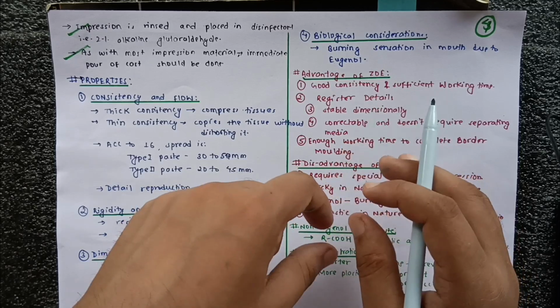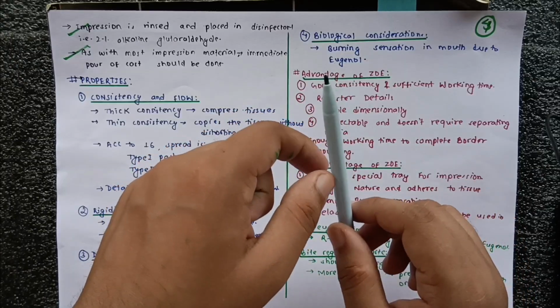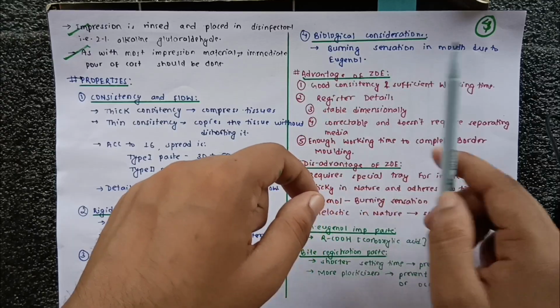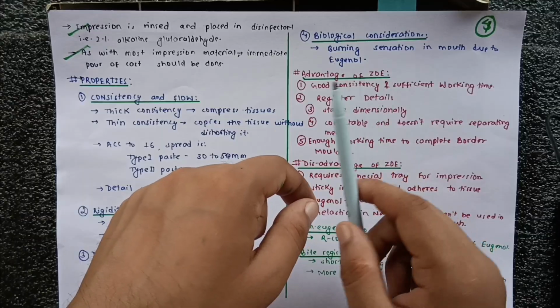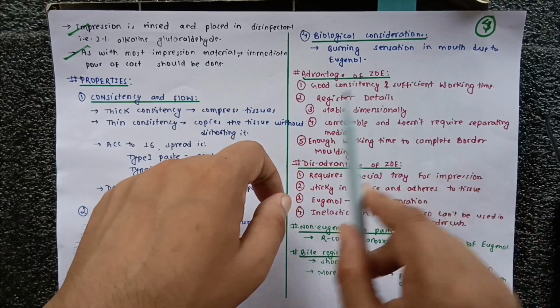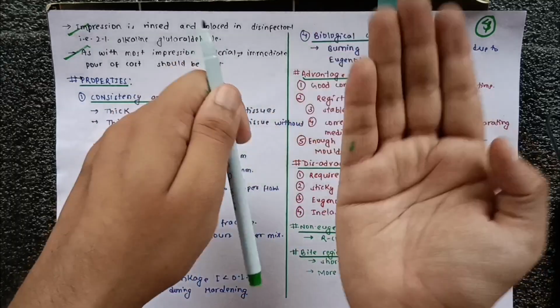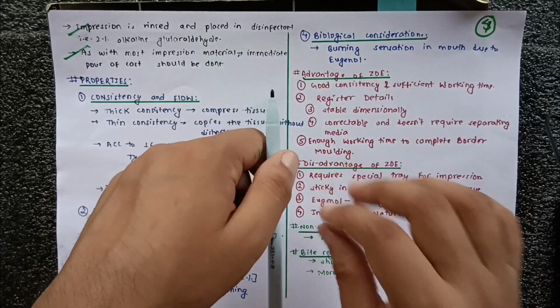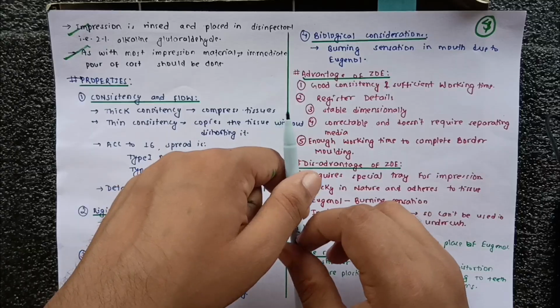After dispensation, we take the proper stainless steel spatula, and we start to mix both the pastes, and we mix properly. We move our hand in a circular pattern, or we can sweep like that, or we can do it in a circular motion. Our main motto is to give the proper mix to that substance. You can move in any pattern.